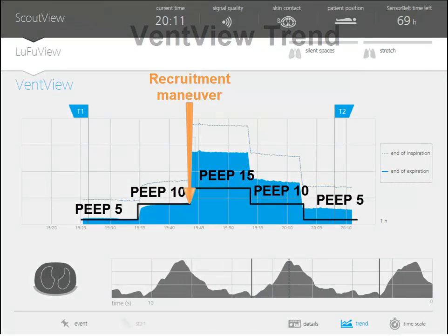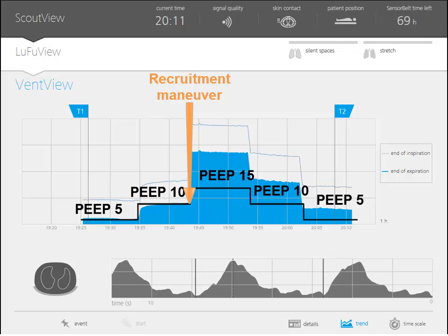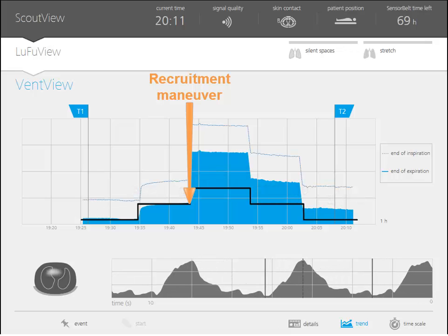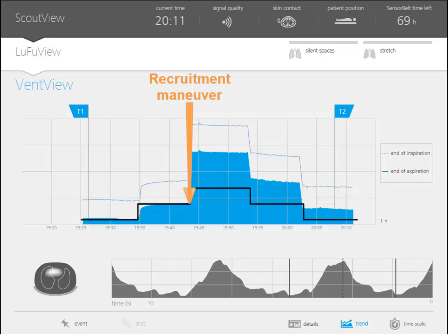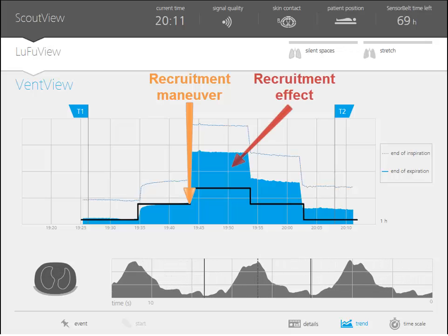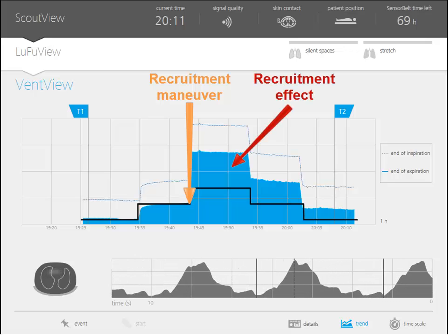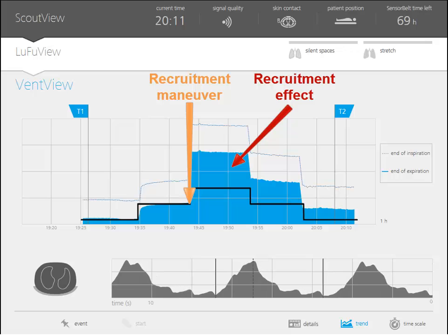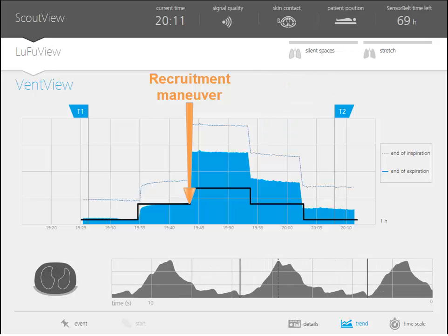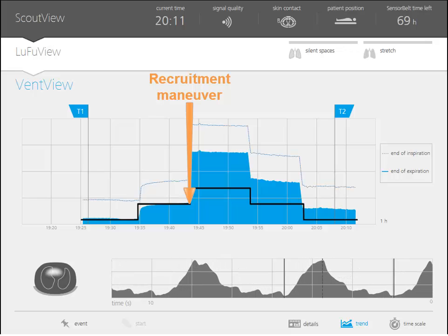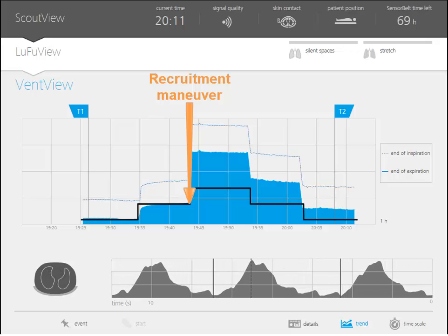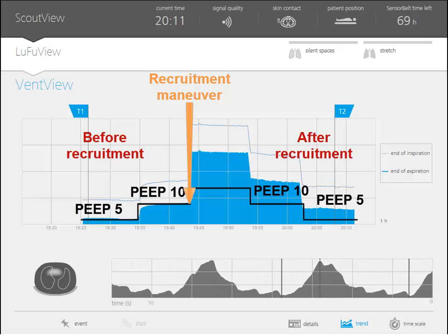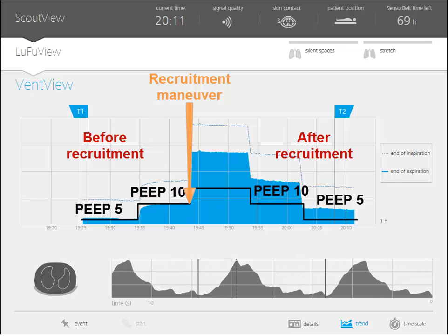Here, the trend of expiratory lung impedance during the entire PEEP titration is shown. When increasing PEEP, the end expiratory lung impedance increases as well. At 15 cm of water we notice a recruitment-induced, more than proportional increment in end expiratory lung impedance, indicated by the blue area above the PEEP line. With every subsequent reduction in PEEP, end expiratory lung impedance decreases while still remaining above the PEEP line.